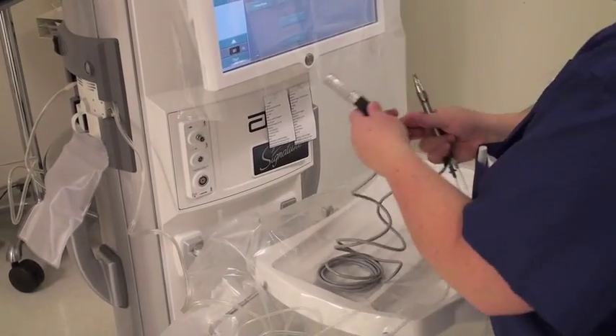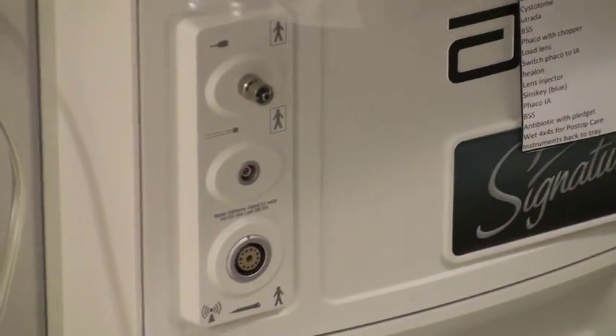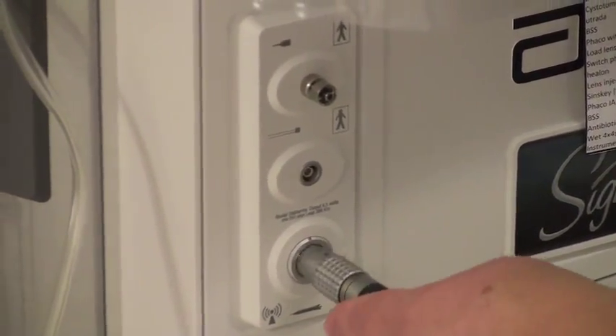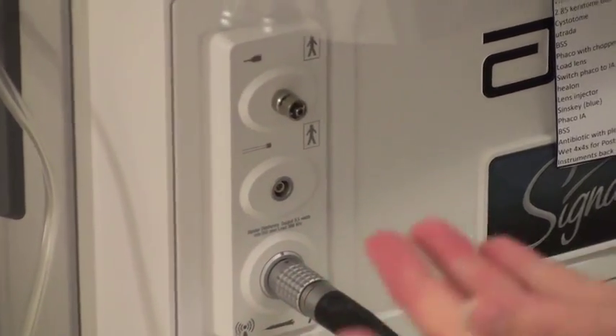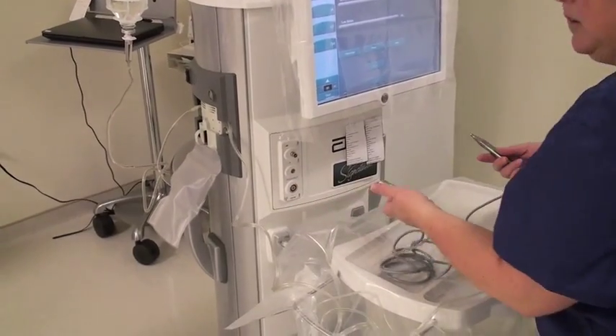Then you're going to plug it into the phaco machine. It has a little red dot here and there's a red line there, and you want those two dots to match up. You just put it in and push it — that's all you do. To take it out, you pull back on this silver sleeve and pull it out.